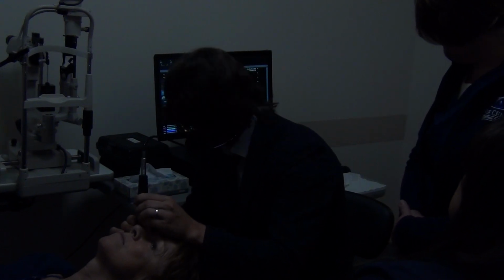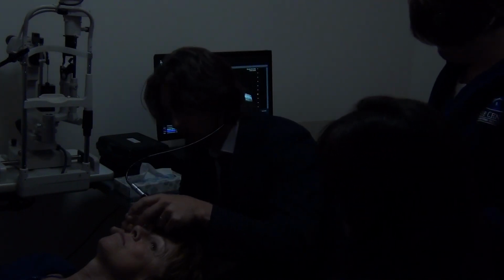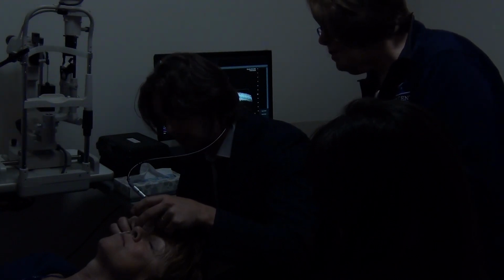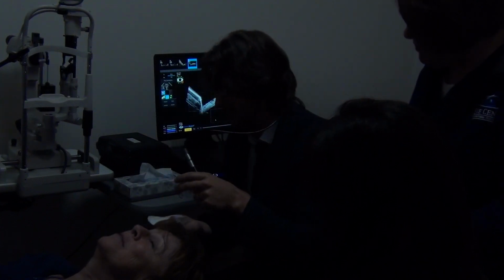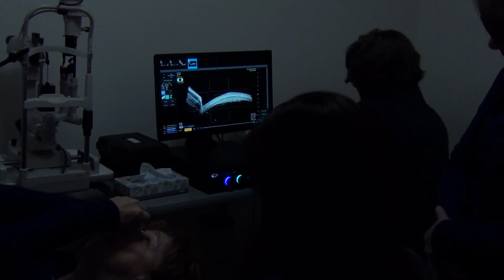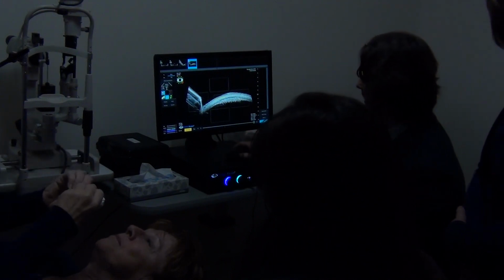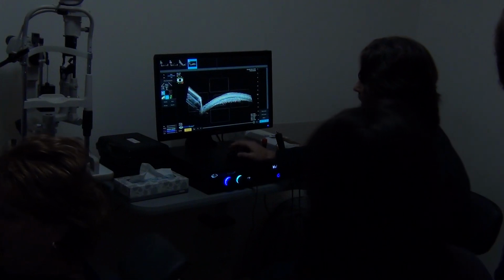Slightly more to the left. Okay, here we go. Alright, then we will remove the cap. Usually pull one of the leads and let water go. Ugh. Yeah, a lot of water. Sorry. That's alright. Kind of feels good. My eyes are so dry. Being washed, right? Can you do the other one? Okay, so once we've done all the scans, we can set you up so we can see what we've done.